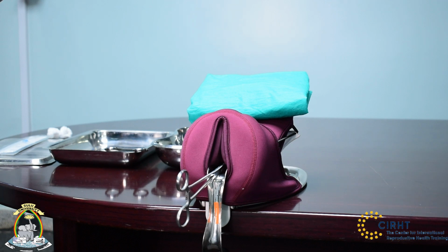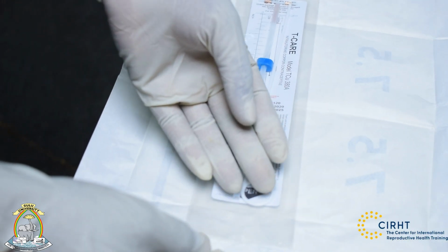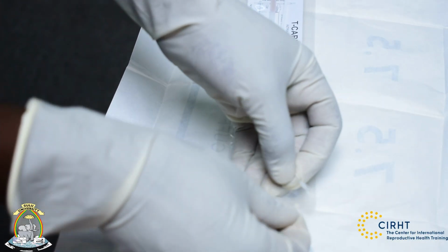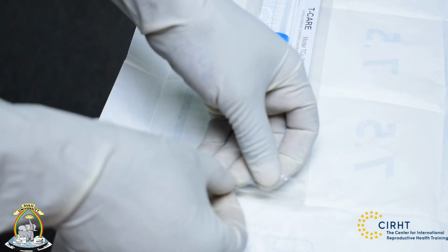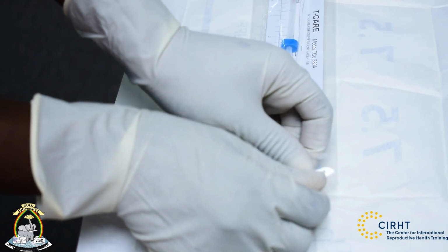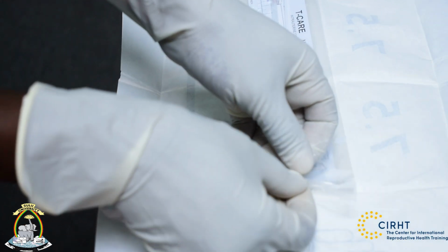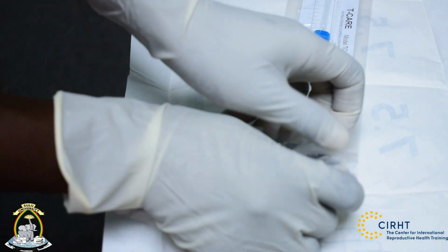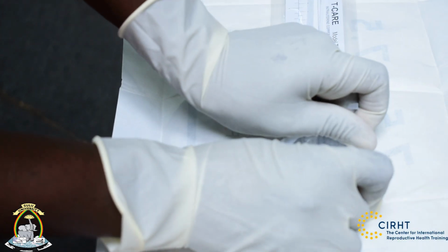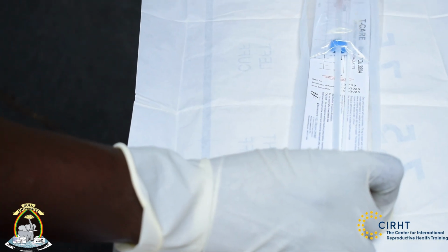So having done that, we are going to open our sterile package of the IUD. All right, so we are going to open our IUD from the bottom of the packet. So we shall open it all the way up until we have opened up to 1/3 of the packet. Up to about here.